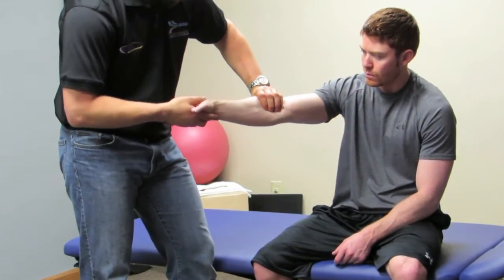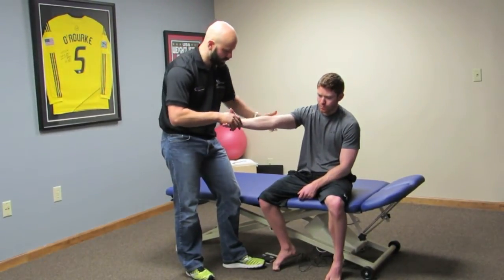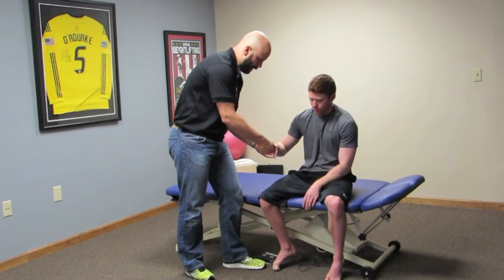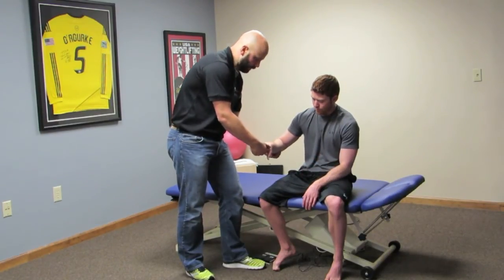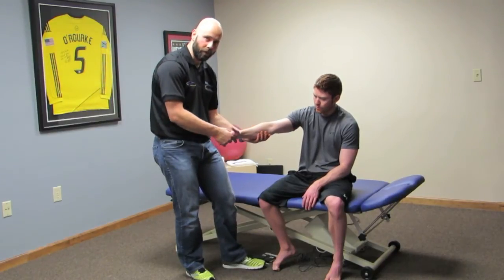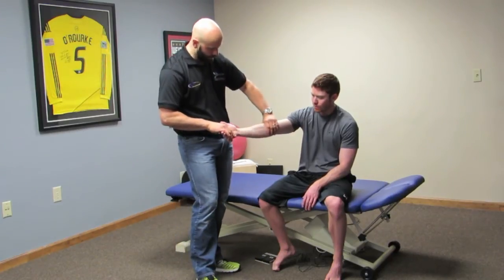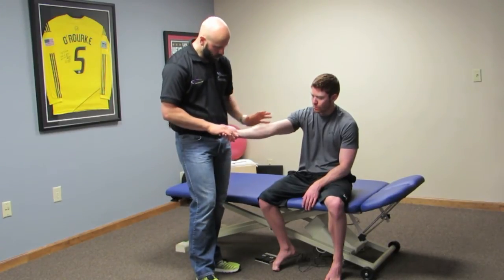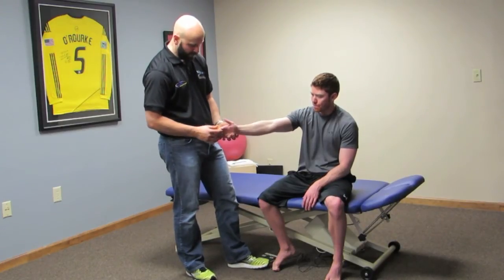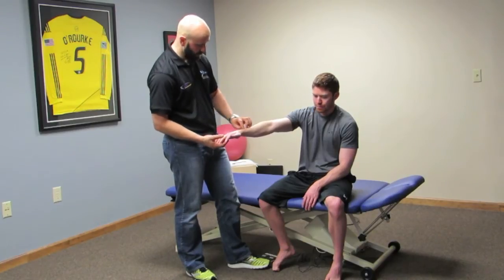I'm always assessing the soft tissue and length of the flexors. I'm also always looking at the pronator teres, which balances out the supinator. If you've got someone sitting at a keyboard all day in flexion and pronation, they might get a super tight pronator teres that then essentially overworks the supinator because it's balancing it out. In terms of assessment, you have to look at the flexors and check their activity to see if it's a component.